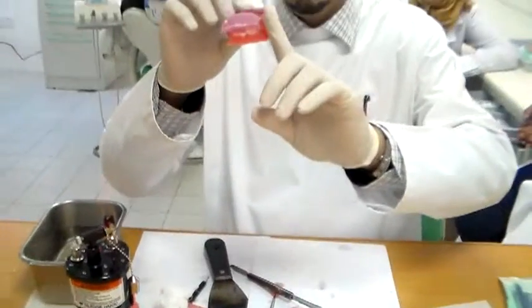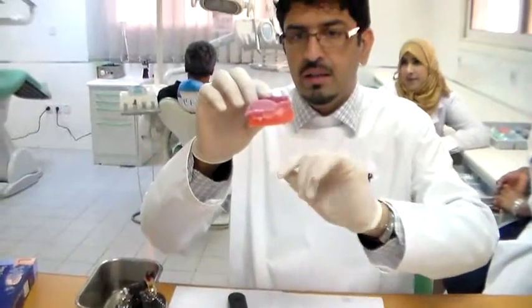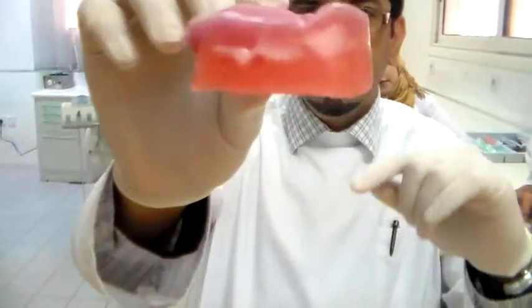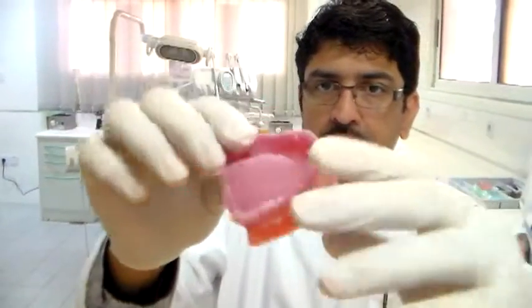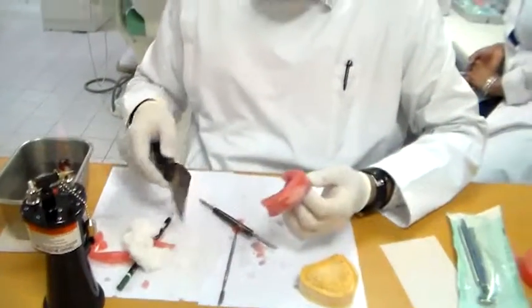Okay, so you see a definite plane there, and this edge is not flat. See, definite plane there. This edge is not flat. I'm going to flatten it with a hot plate.